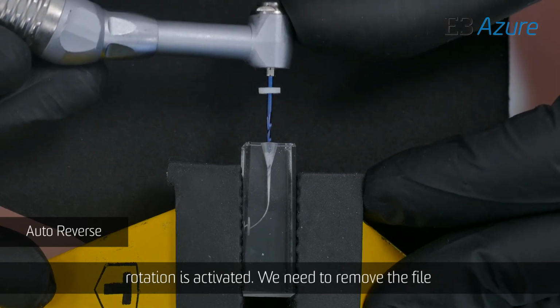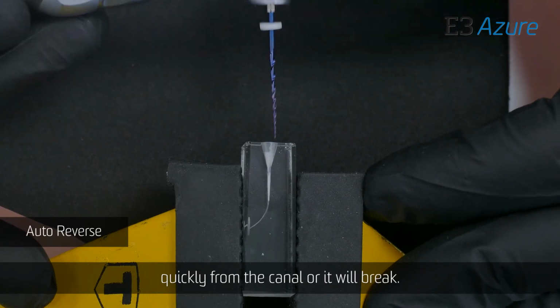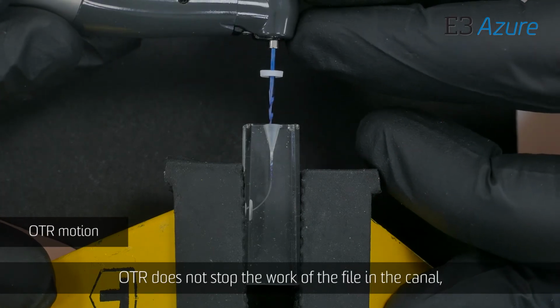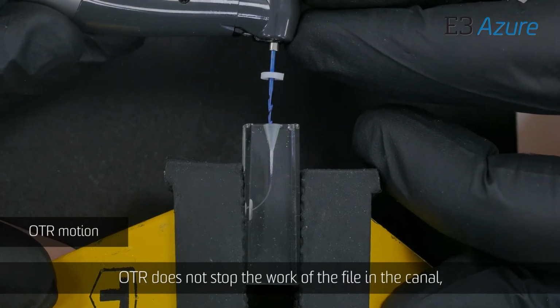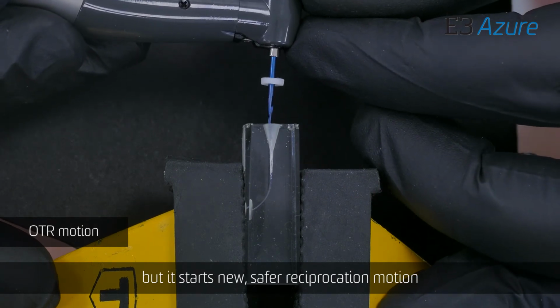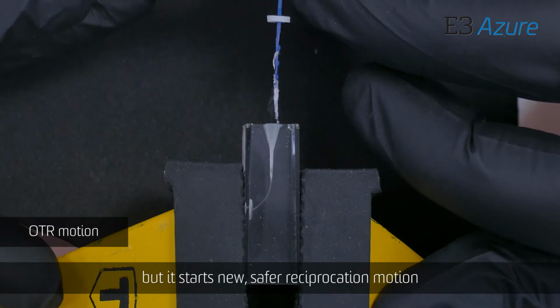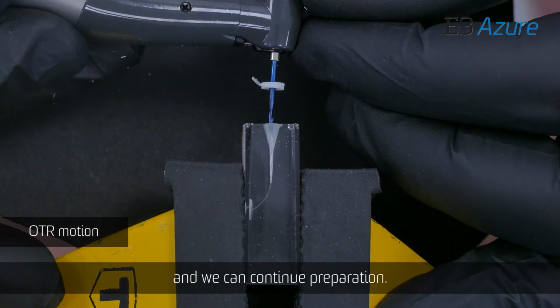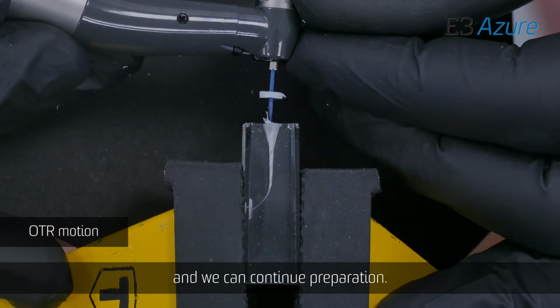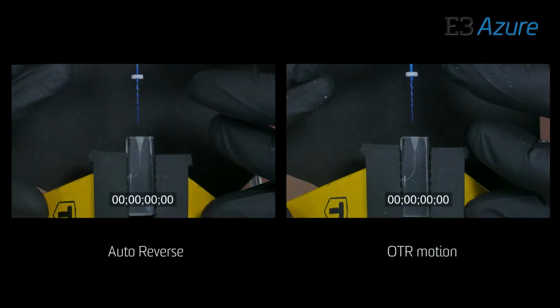We need to remove the file quickly from the canal or it will break. OTR doesn't stop the work of the file in the canal, but it starts a new, safer reciprocation motion, and we can continue preparation. So OTR allows for faster and safer canal preparation.